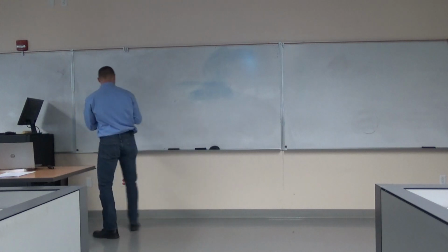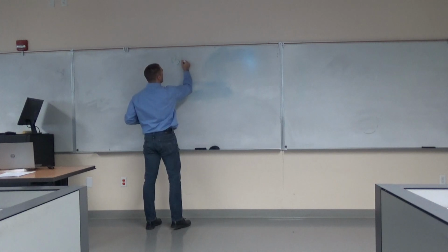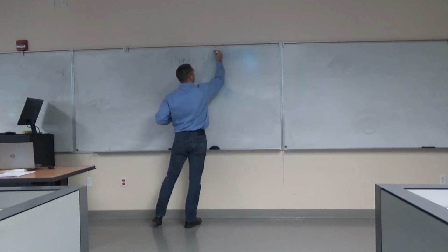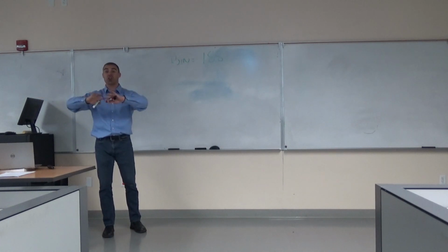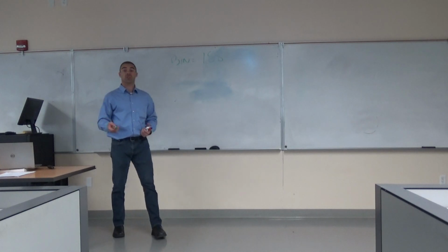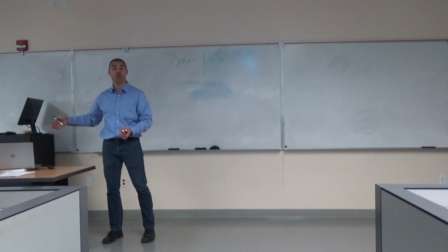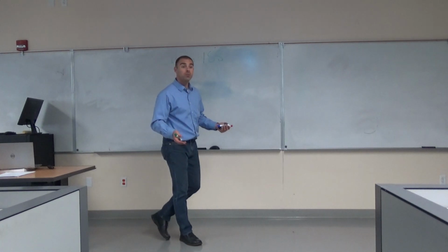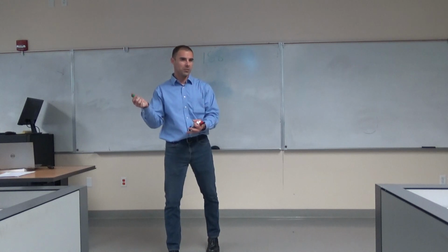Right? So we have this idea that there's this bin, and we named it, in your case, I called it 188, right? So the idea is, and we'll get to this as the course moves on, but just generically, it's just the name of the condition of the memory experiment that we want to plot, right? So maybe if we're studying memory, you could look at the brain activity for when we remember, right? But there could also be a totally different category of times that you want to know, what does the brain activity look like when we forget? Right? Or how about when we just kind of remember a little bit, but not all of it? Right? Somewhere in the middle.